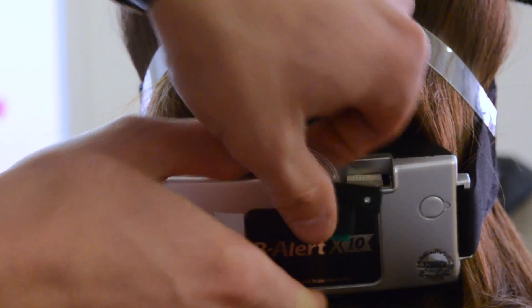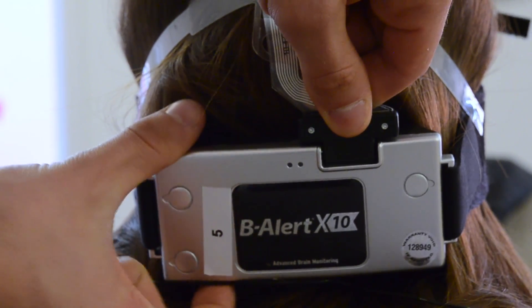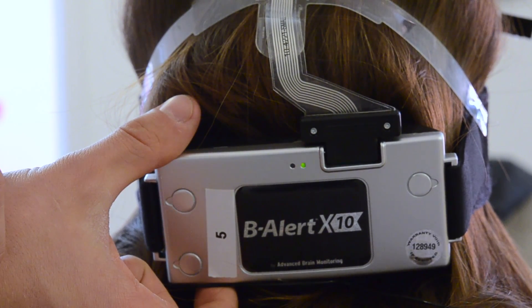When every electrode is in place, we connect the strip to the EEG itself and switch it on. Once the light turns steady green, we know that it has been successfully connected to our computer.